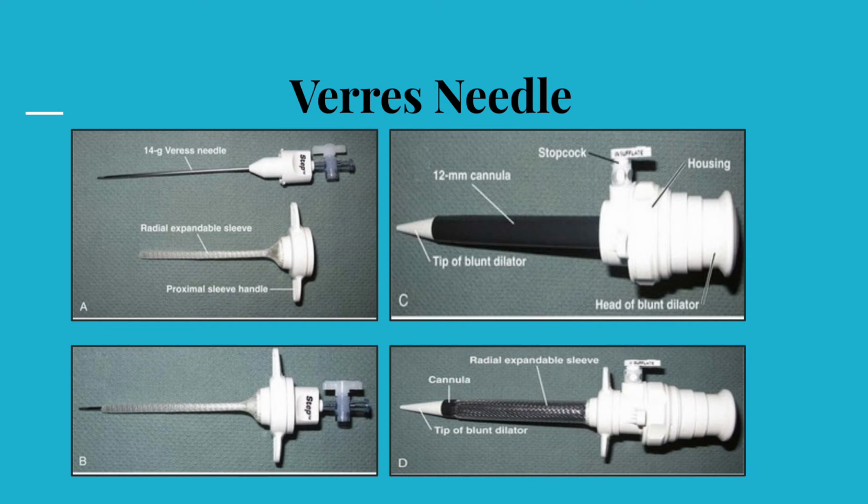the sheath. The sheath itself is an expandable polymer that accommodates the dilator cannula while it is inserted. The dilator component is withdrawn post-insertion, leaving the 12 mm cannula, which is still within the sheath, for laparoscopic instrumentation. The Veress needle method is somewhat similar to the Seldinger technique used for central venous lines or enterostomy tubes.